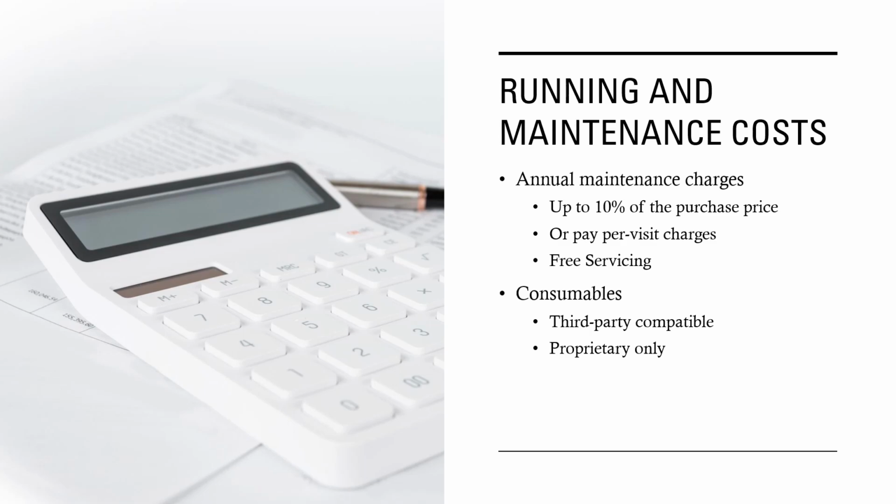The consumables may be third party compatible or they may be proprietary. And just to give you an idea, I would mention here that Medlab's cutter 23 gauge, which is a generic company making cutters for various machines, will cost you something like 4,500 or 5,000, and a proprietary cutter for Oertli will cost you something like 13,000. So there's a huge difference the moment you switch to proprietary machines, which may not sound very fair, but this is how it is. So one has to keep that in mind when you are buying your machine.